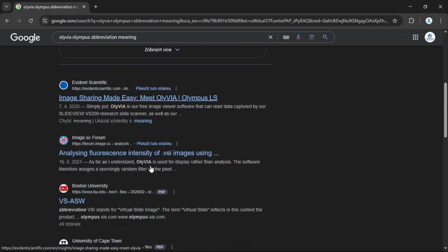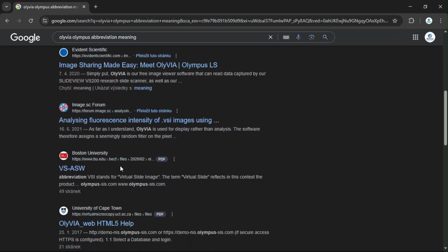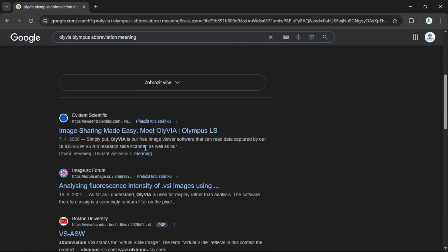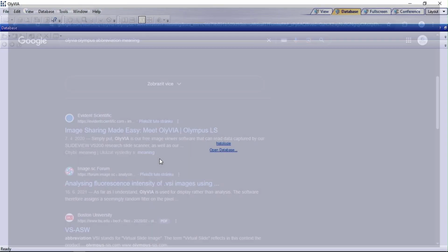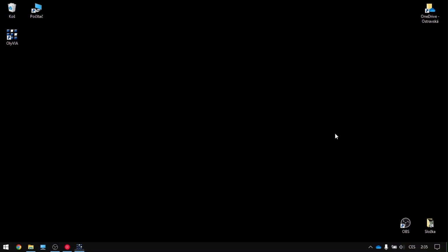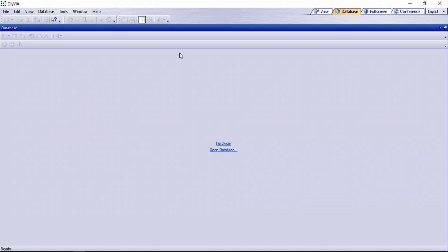I suppose it's an abbreviation: Olympus Virtual Slide Image. Yeah, that makes sense. Right. So this is the program.